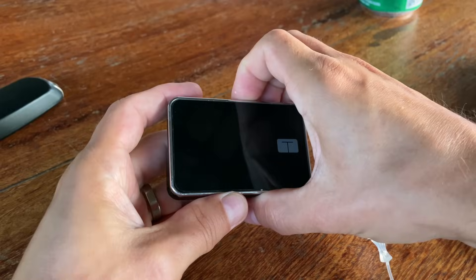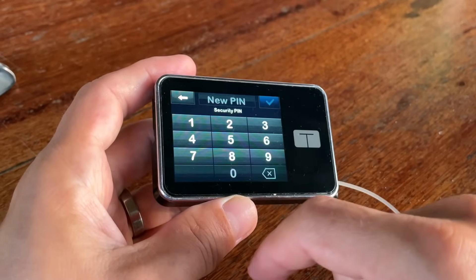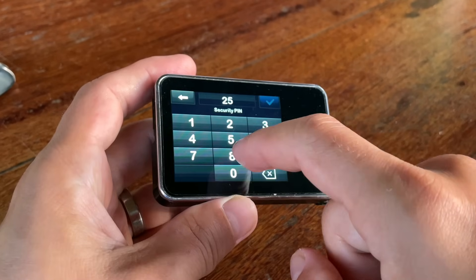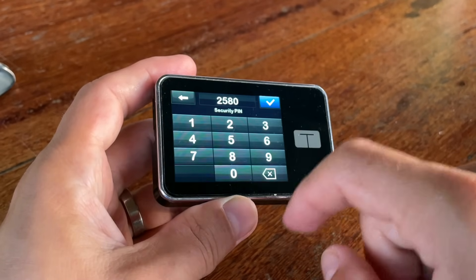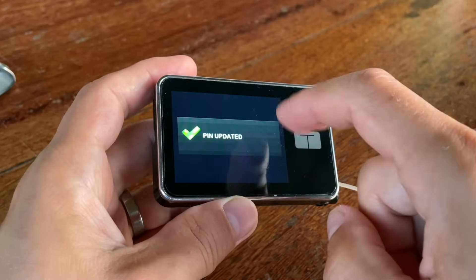The pump also has a lockable screen. You unlock it by pressing 1-2-3, and on top of that you can secure it with an additional four-digit pin code. I personally find this overkill, but you can activate it if you need an additional level of security.